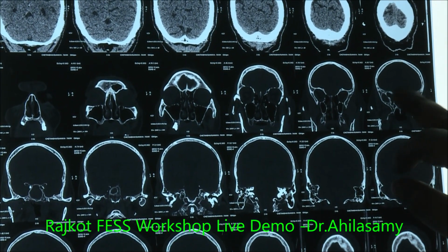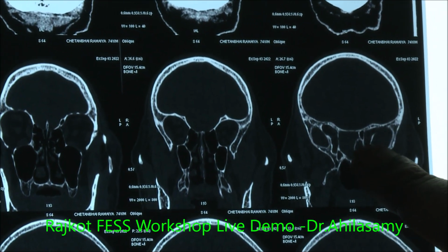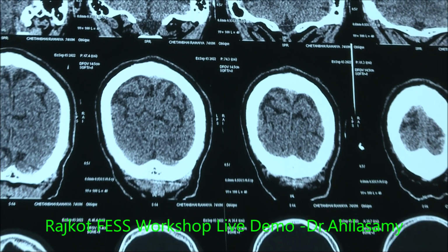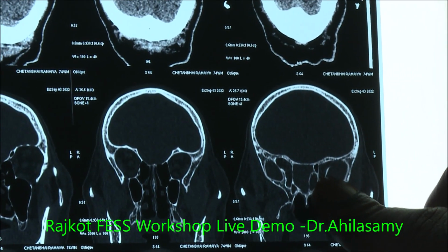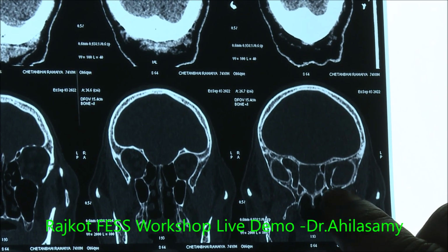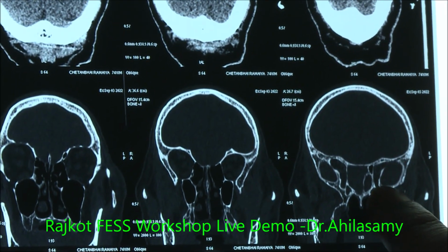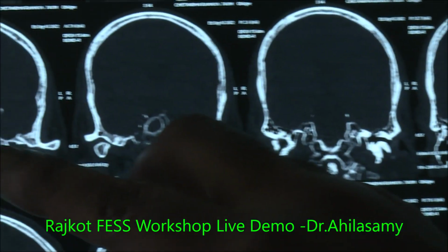There is a large right sphenoid, which is heterodense, and a very small left sphenoid. I think that's only mucosal thickening, not disease. I have to be very gentle at this point, because it is only the anterior part and a very small sphenoid. Posteriorly, it is fully communicating.